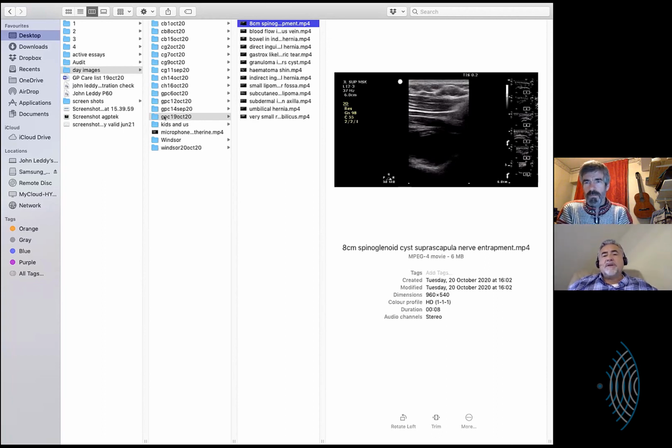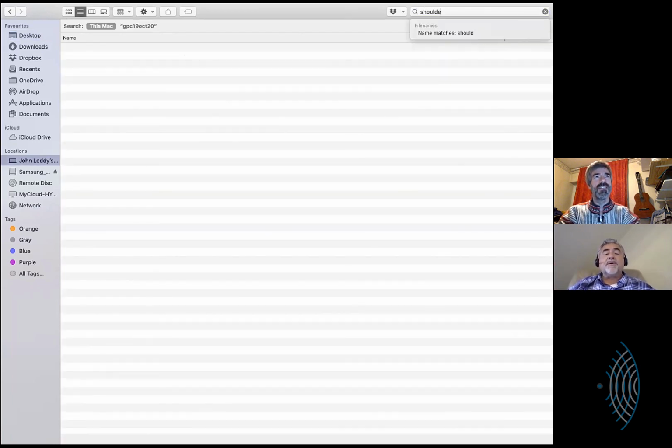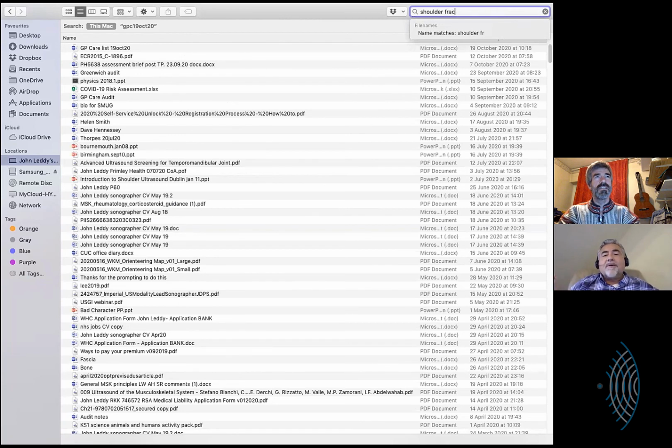I would just love to have you sideline that particular thing into a series of still shots for me, to be able to say, hey, Greg, this is normal, this is normal, this is normal. This is what we see when there is an actual compromise in the humerus that indicates a fracture. Because I remember when I was first scanning my kids, I would come across what I think was a nutrient foramen in the bone, and I would go right through it. If you held your probe in the right spot, it looked as though there was a fracture, but move it a millimeter or two, and it comes back together, like where a vessel goes into the bone, there's this little pock.